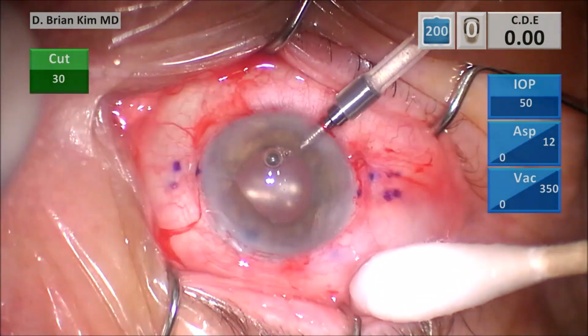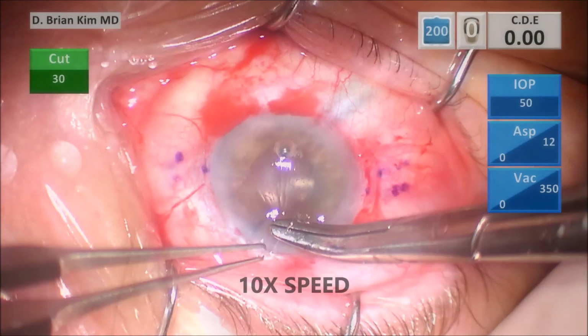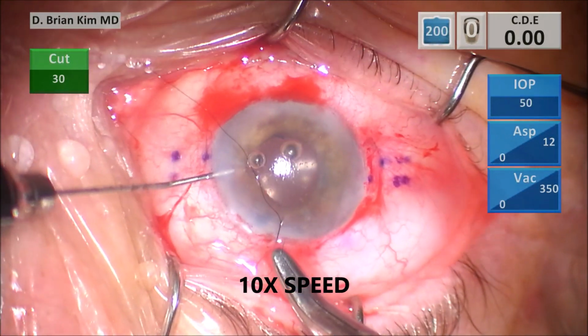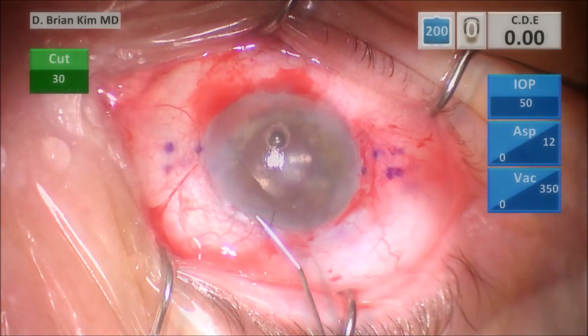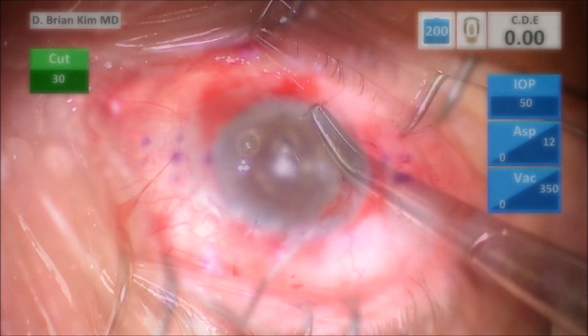You saw when I pulled that trocar out, there wasn't any fluid coming out. Again, it was a nice self-sealing trocar, and you know this because the trocar was sitting slightly sideways, which means there's a nice scleral tunnel when I placed that trocar in. You saw I was removing some more viscoelastic, and I placed the suture, and I'm hydrating my incisions.